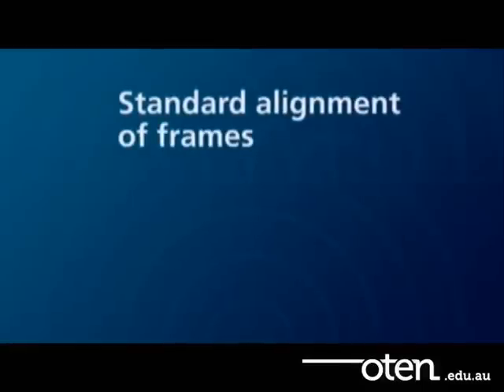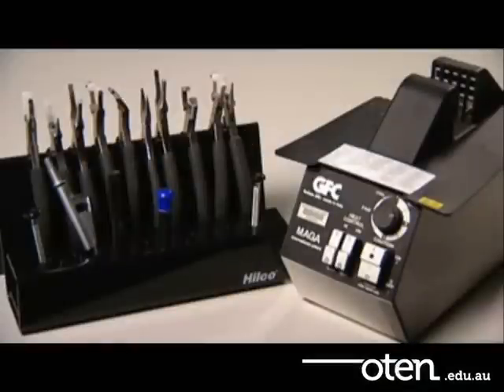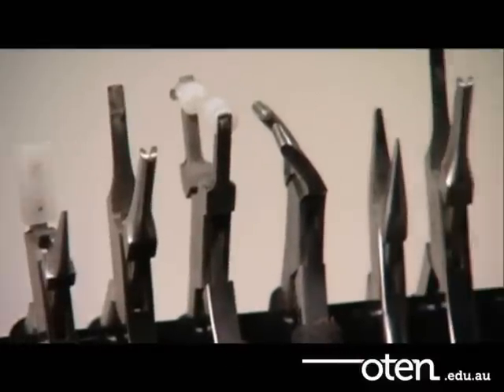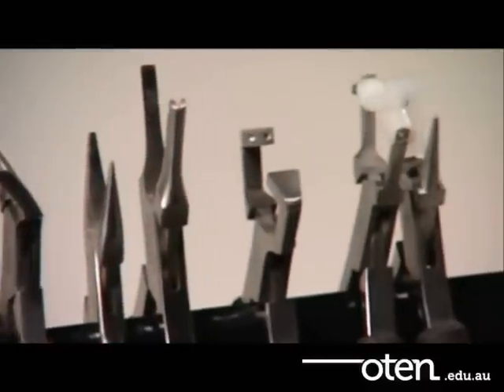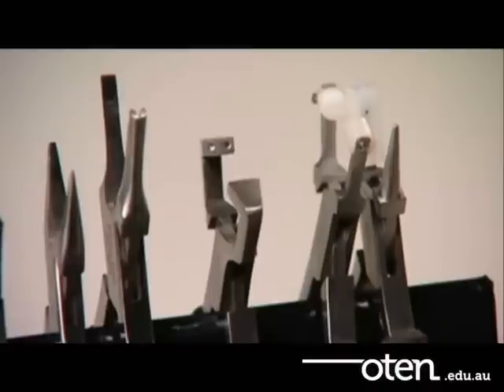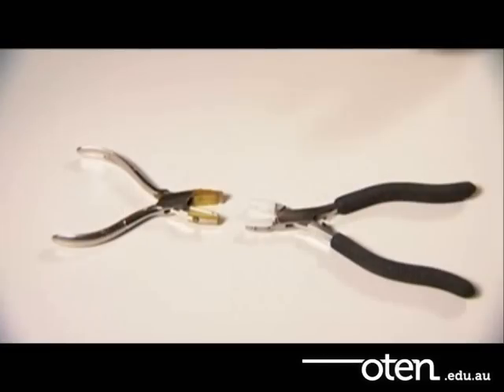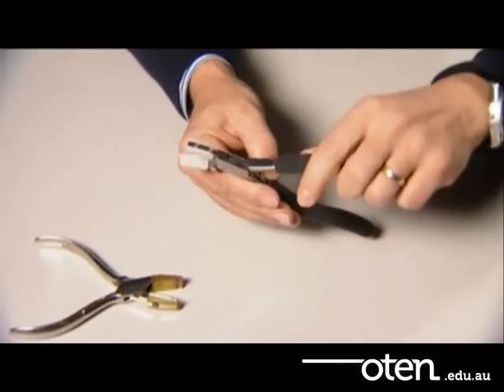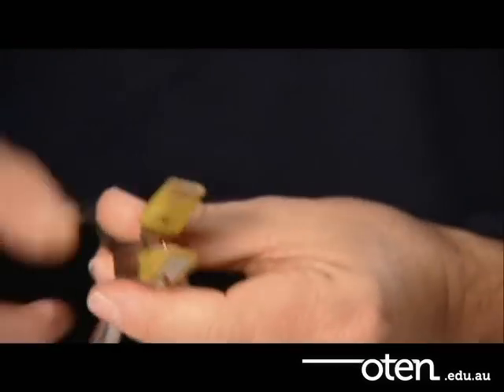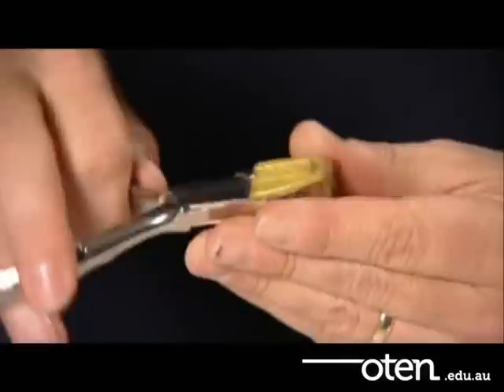In this video we will be looking at standard alignment of frames. Always use the correct tools. Avoid trying to use your hands alone as they are not fine or strong enough to make most of these adjustments. You can also hurt yourself if you don't use the proper tools. Check your tools before you begin. Inspect the plastic fibre jaw pliers to make sure that they are smooth.